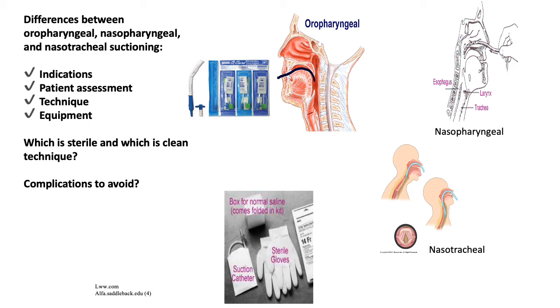If you do get a small amount of bleeding, that is something you can watch, but if there's a lot of bleeding, then you need to notify the healthcare provider. Other potential complications can be laryngospasm or bronchospasm, and irregular pulse rate. So we monitor our patients, keeping them on the pulse ox throughout to watch for those things.